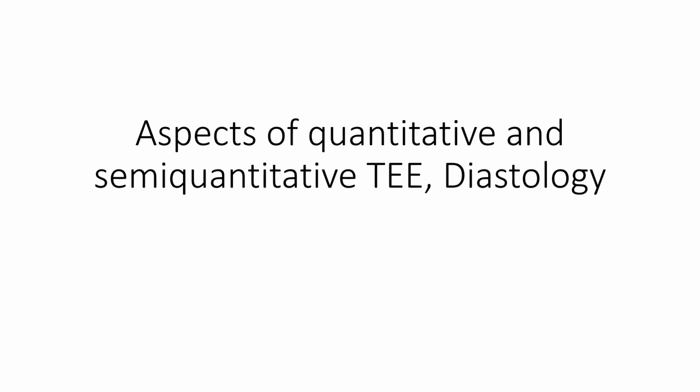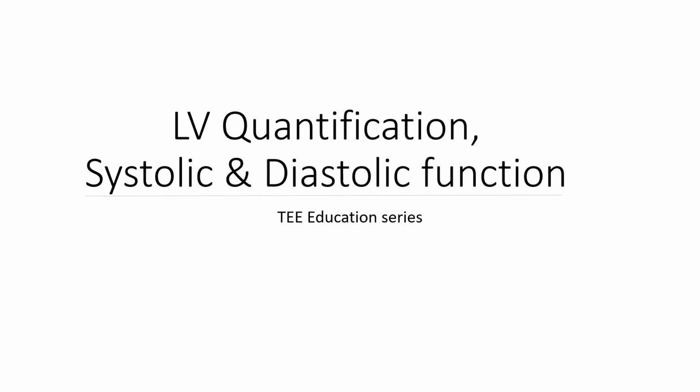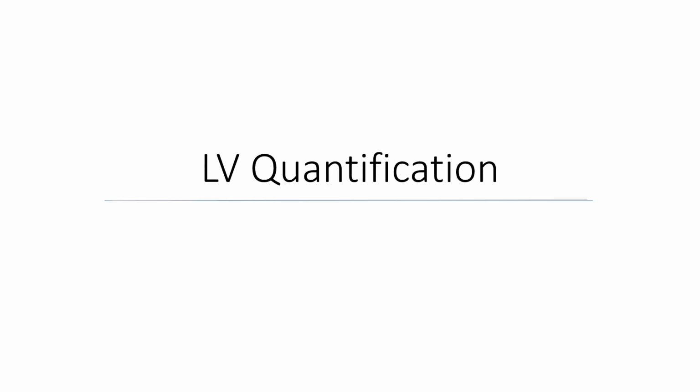The assigned topic for this lecture, the official topic, is what's on the screen. It reads aspects of quantitative and semi-quantitative TEE and diastology, which almost encompasses everything there is to know. So I am going to narrow our focus a little bit and say that we're going to talk about LV quantification and how to quantify systolic and diastolic function.